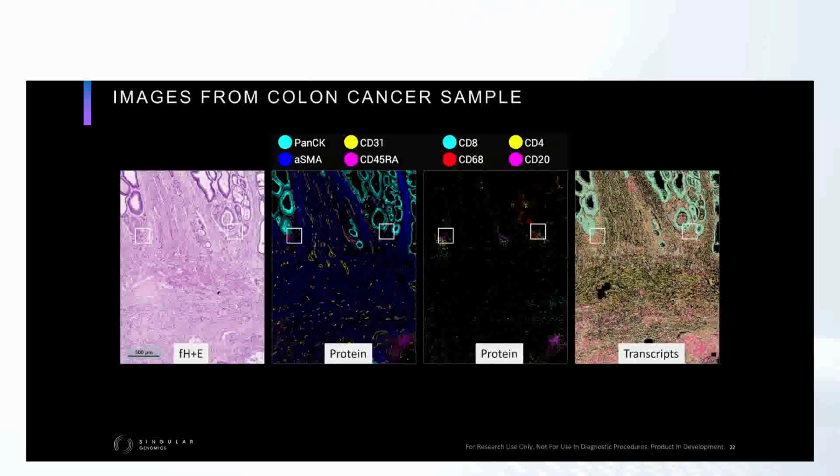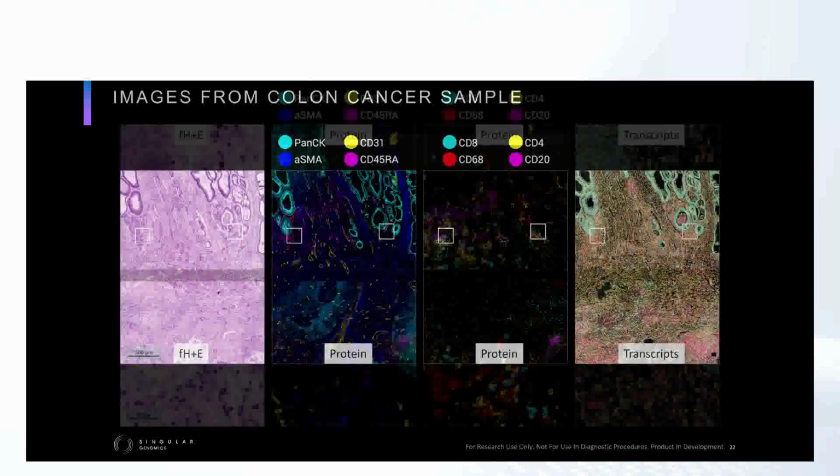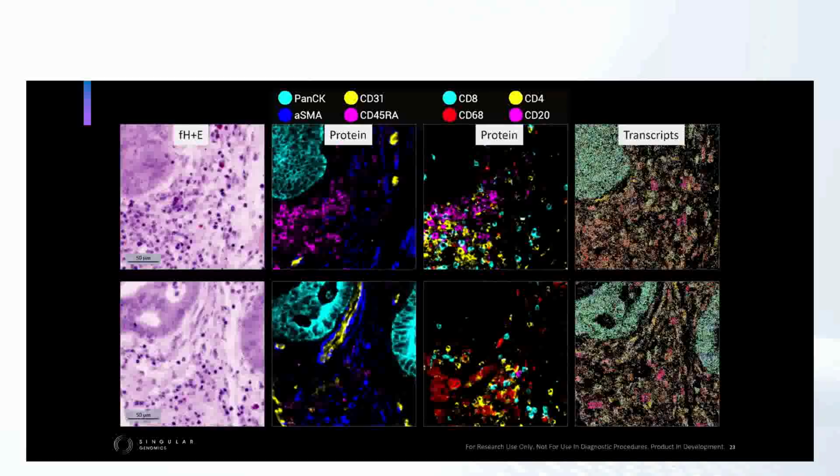And then these are just images out of the system, the fluorescent H&E on the left. We have 8 different proteins that we're showing here just for visualization. You can view them all together if you want, just gets a little messy. And then the transcripts. So kind of zooming in at the single cell level, you can see some of the key protein markers and around the structure, and then some of the immune markers as well. And you see really nice morphology and good ring-like structure around the cells as expected.